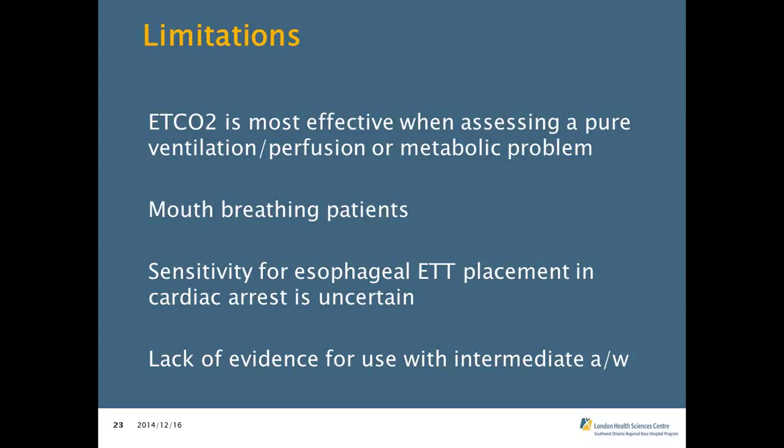So how that becomes applicable to us is look more than once. Don't just look at the screen and go, oh, I've got an EndTidal reading, I must be in the trachea. Make sure that you take a couple of glances over a couple of minutes and ensure that you have a sustained EndTidal CO2 reading. Absolutely part of your monitoring, because we all know, tubes are finicky and can become dislodged, especially on the transport. So it's part of your monitoring.